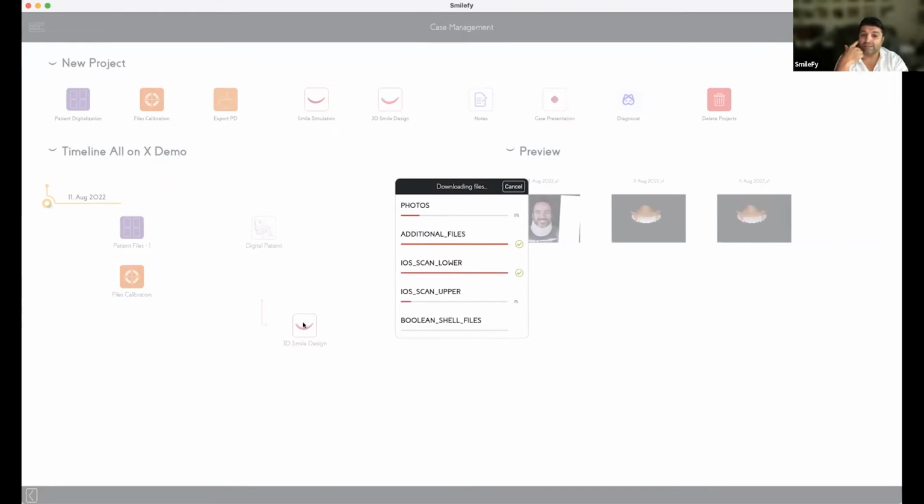Because if we can connect all the teeth, then we can create also a full arch implant bridge without a gingiva. And if you have cases in which the gingiva is good and healthy, then you can just put the prosthesis of the teeth on top, and it looks beautiful. It looks very natural. That's something that we're going to also add, because that's really a thing of a couple of days.